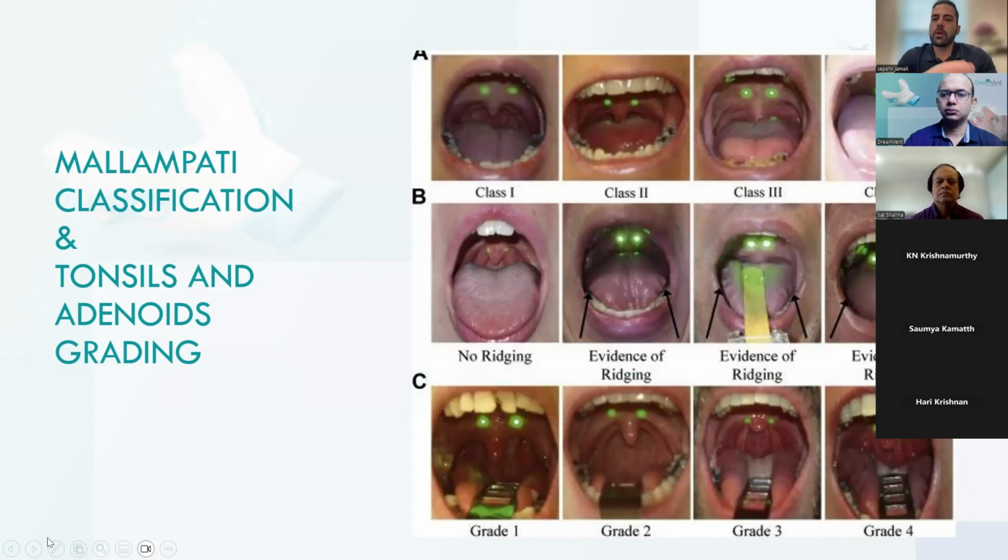But even if I want to make a night guard or mouth guard for them, I'm going to be more aware of the fact that we're going to design it in a way that is airway centric, so it's not going to hinder the breathing ability. And I'll also tell them to check their quality of sleep. A lot of times the patient can see if their quality of sleep is going down. That can also be a risk factor for them, that can trigger them to go and do the proper sleep study and get the proper diagnosis.